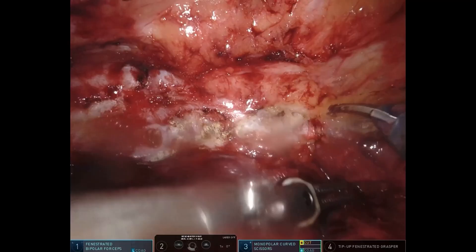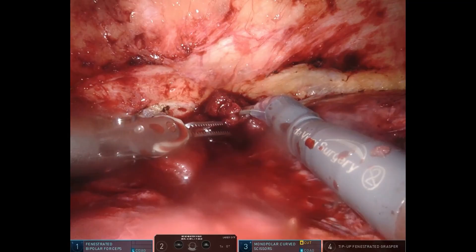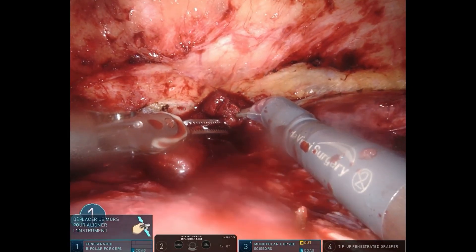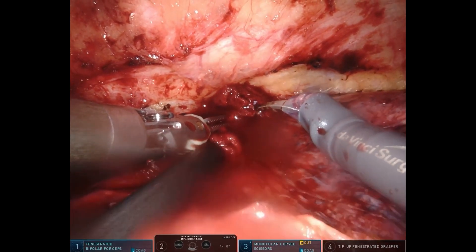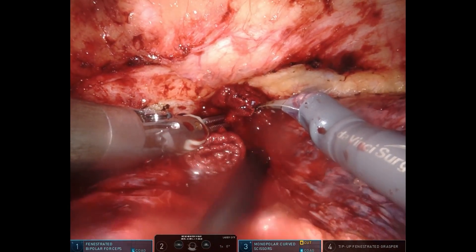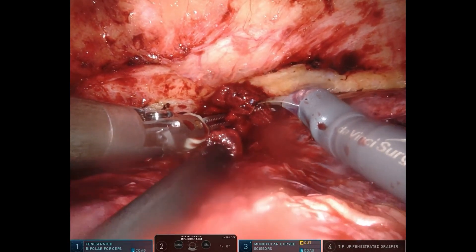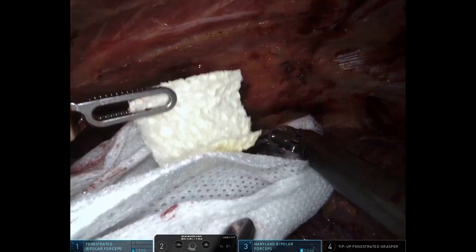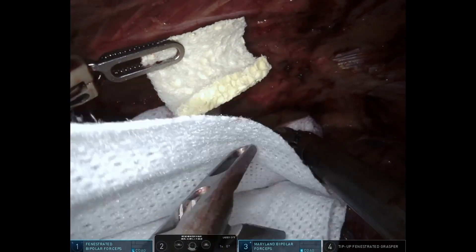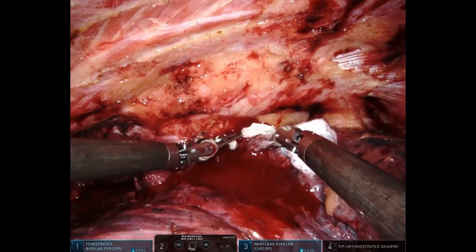In this case, during a pulmonary resection with dense adhesions to the chest wall, a subclavian vein injury occurs, leading to significant bleeding. Immediate compression is essential to prevent further complications. Using the contralateral robotic arm, the hemostatic patch is applied directly to the injury site, followed by immediate gauze compression to optimize patch positioning and adherence.